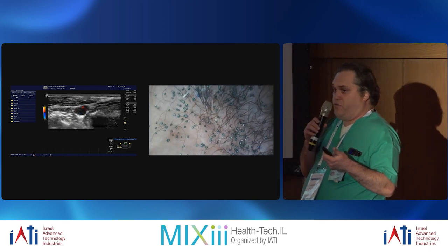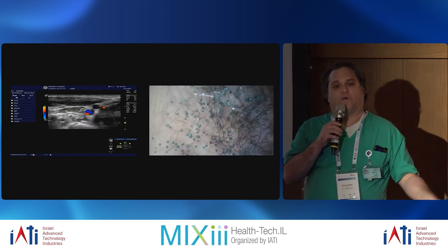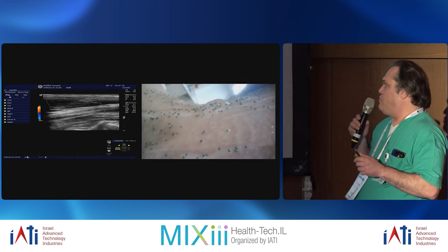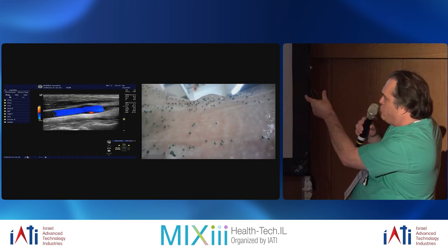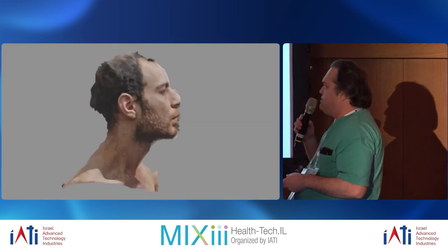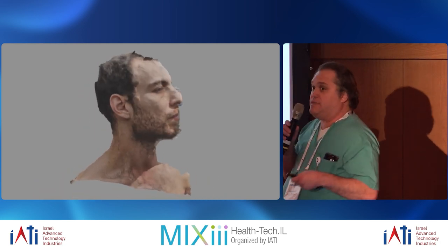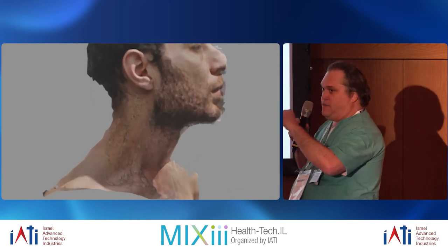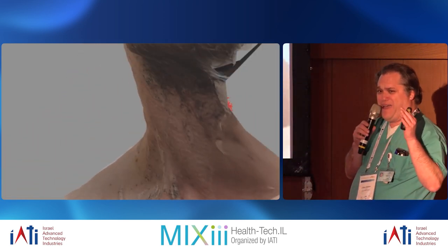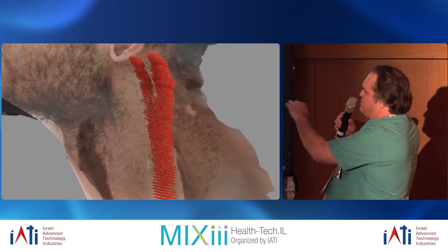After the computer reconstructs the path, each image has its own coordinates, and now the computer can fuse all the optic images and all the ultrasonic images together. I tried to trick the computer by doing a longitudinal view, but the computer got it right. And this is the solution. You see the 3D image of Doron's neck, inside of which you can see the ultrasound image: a lot of axial slices of the artery inside Doron's neck. And it's in the right orientation, the right depth, the right velocity. You see all the axial views.